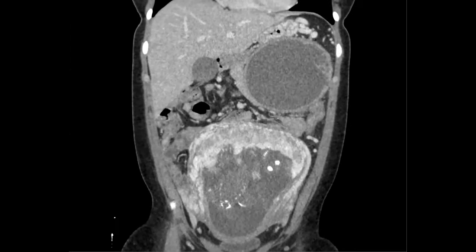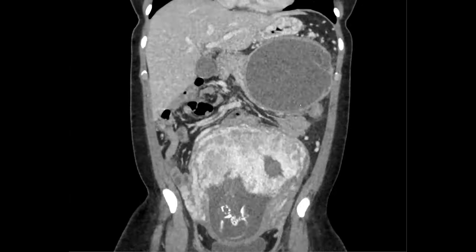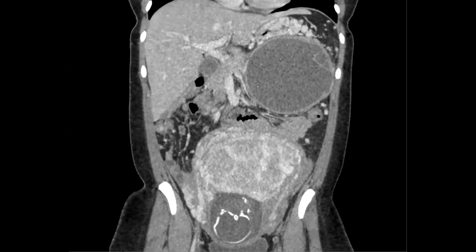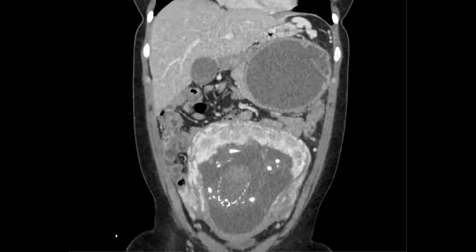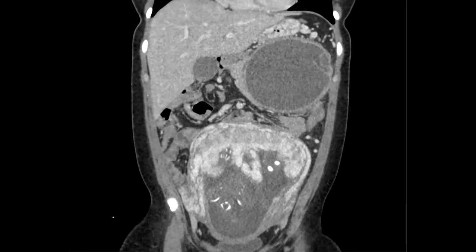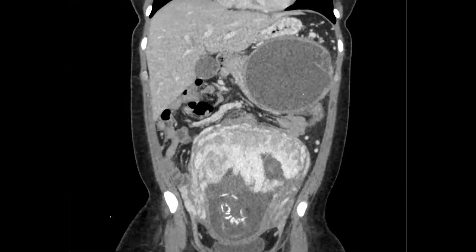Spen tumors are in a younger female population, but they tend to have more solid components where the pseudopapillae are, and then more hemorrhage centrally. Anyway, this was resected, and this turned out to be an oligocystic serous cystadenoma with hyalinization of the wall and abscess formation. So I don't think we could have predicted that. Everything about this looks a little bit more like something else, especially the demographics.